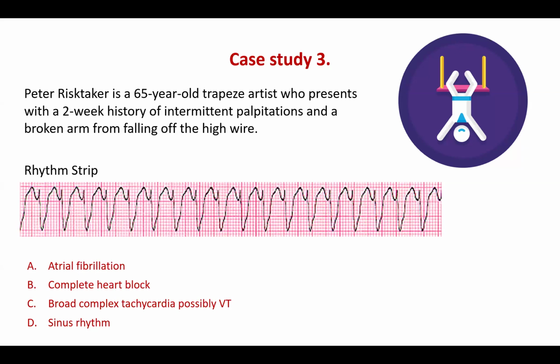It's just around the settings. So would you recommend changing the settings on an ECG machine? There is a setting for reducing the AC noise, but does that reduce it? Can they tell if it then changes the accuracy of an ECG?